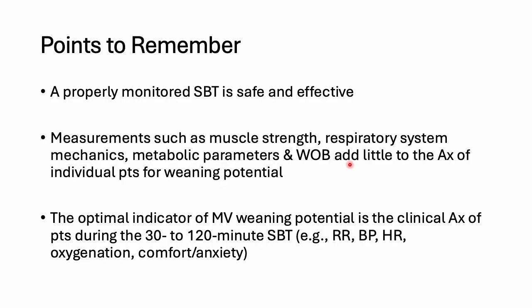But of course, the stronger the person is, and the less work of breathing there is, the better it is in terms of the patient being able to breathe on their own without the support. Okay, as I mentioned before, the spontaneous breathing trial is done 30 minutes, 1 hour, 2 hours, and then ABG is done, the clinical assessment is done, then the artificial airway is removed or extubation is done, and then the mechanical ventilation is stopped.